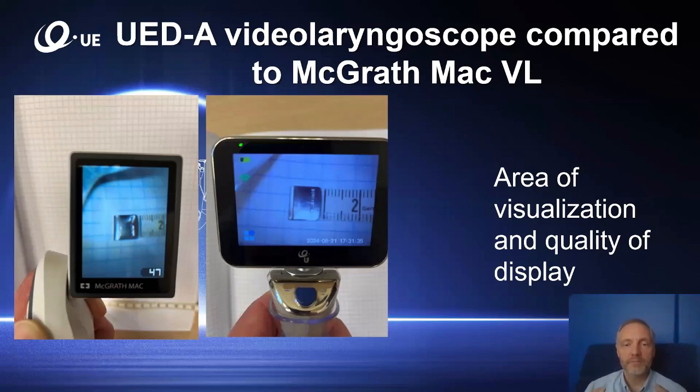So it may prevent possible complications regarding misdirection of a tube when you try to insert it in the larynx of the patient. So a wider area of visualization is definitely better and safer for the patient.